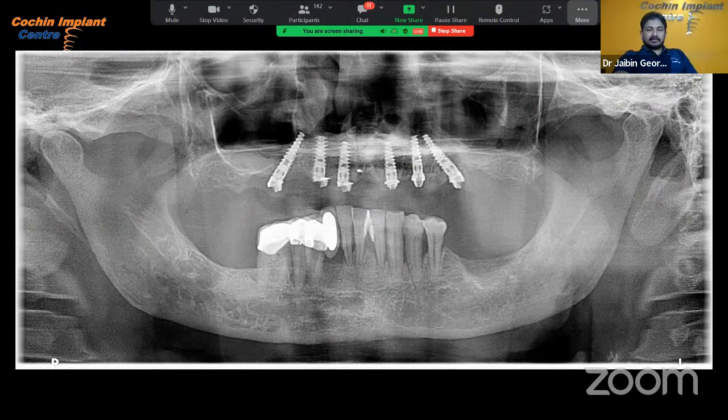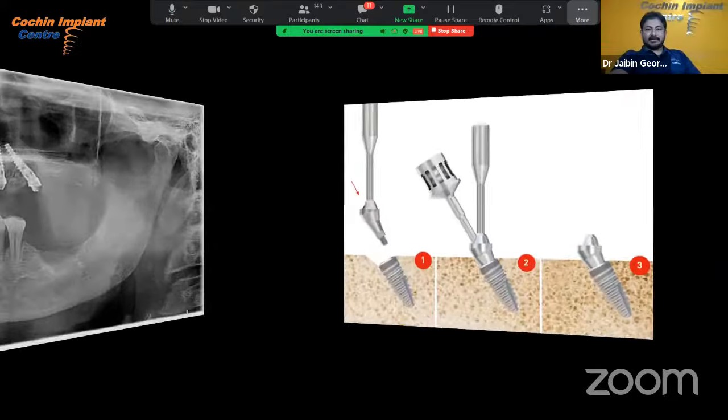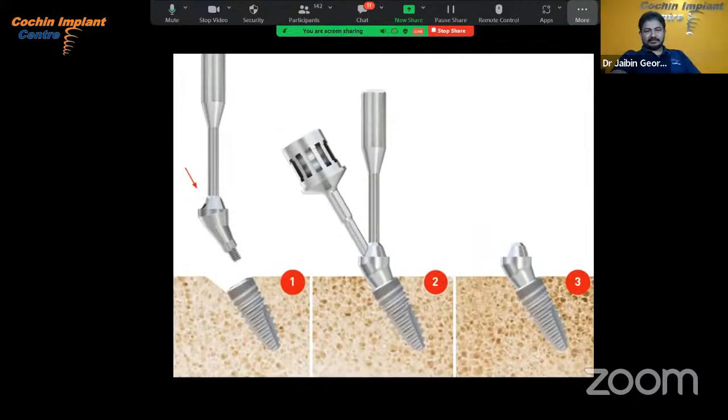6 implants, with the distal-most implants tilted maximum to get maximum AP spread. Longer implants were used. We could achieve bicortical anchorage so that we can load it immediately. And in this case, we have made a conversion process.